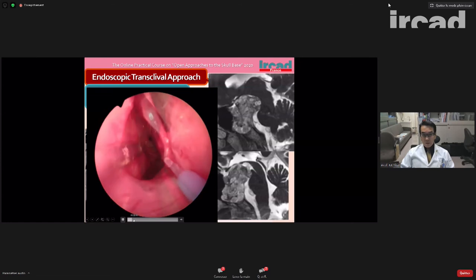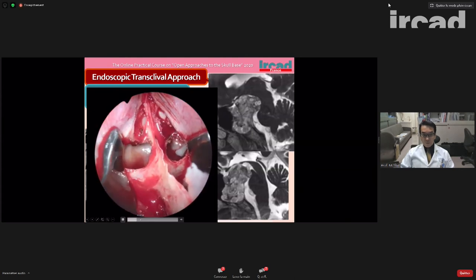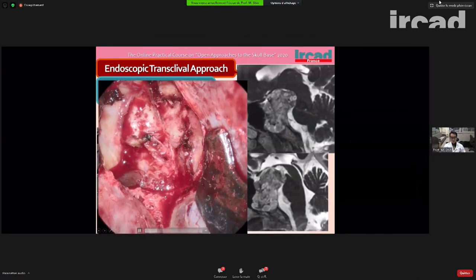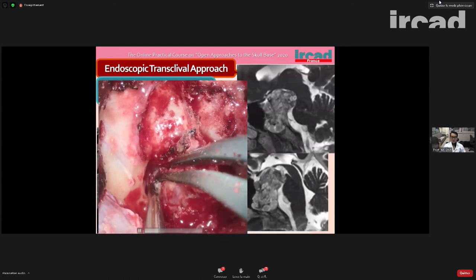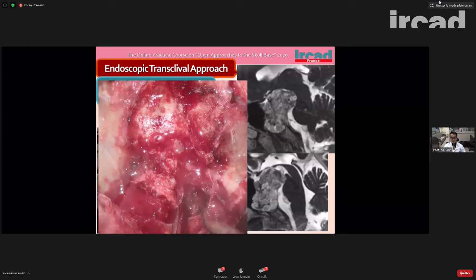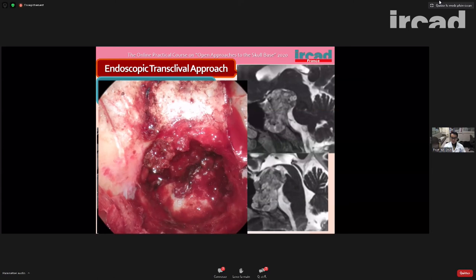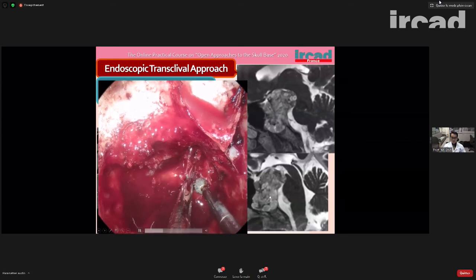The septal dissection and using the specula like this. And wide exposure of the sphenoid sinus. First we remove the tumor component in the sphenoid sinus. Piece by piece resection. Then we go into the intradural space. We drill off the clival recess.